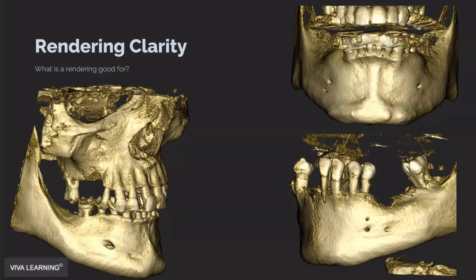There's just different algorithms on how the machine and the software will then show that in a three-dimensional model. There's not much functionality in the three-dimensional model besides maybe gross anatomy. Like here you can see the mental foramen, or in the case on the top right, a double foramen, and the bottom right, a triple foramen. But you can't trust the 3D rendering for caries or for big, small things, right? So we might be looking at general anatomy with the rendering.